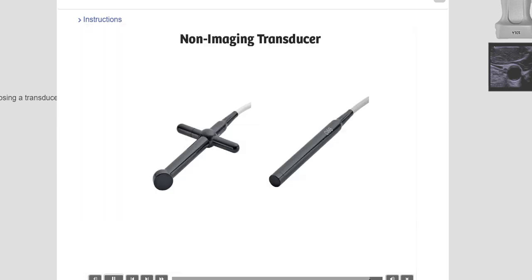Non-imaging transducer. Sometimes called pencil probe. These dual-element transducers create high-quality continuous wave Doppler spectral traces. These transducers can assess gradients across heart valves, produce Doppler blood flow, non-imaging TCD, and Doppler characteristics for peripheral vascular applications. Typically, there is a selectable range of Doppler frequencies in non-imaging transducers.